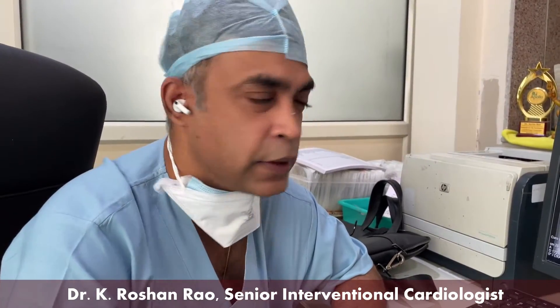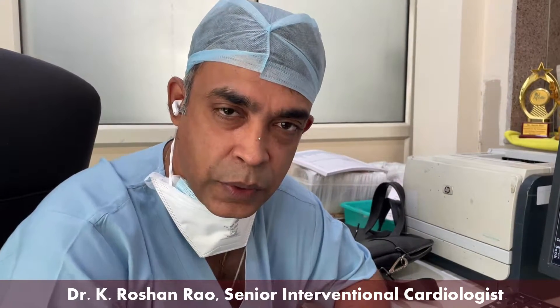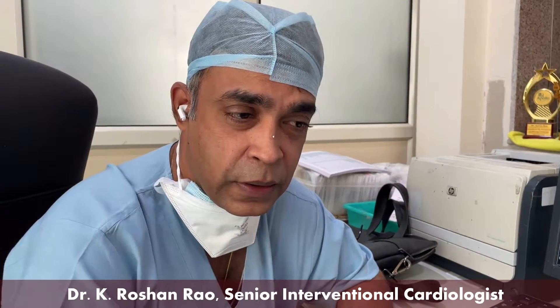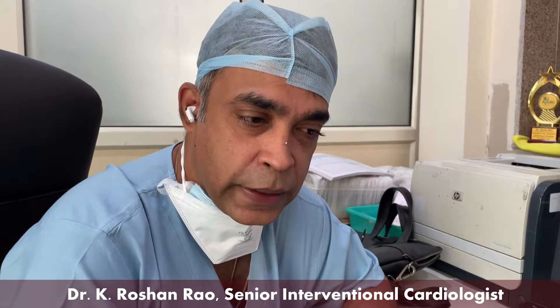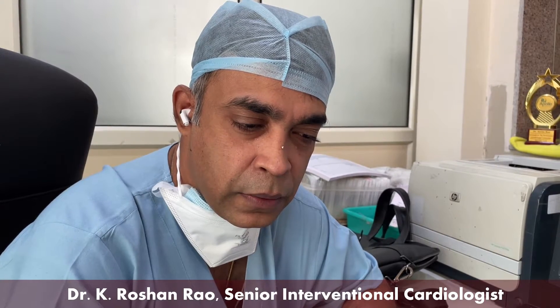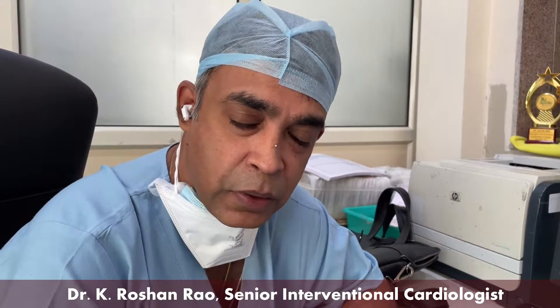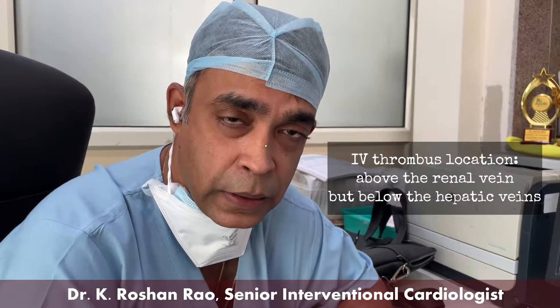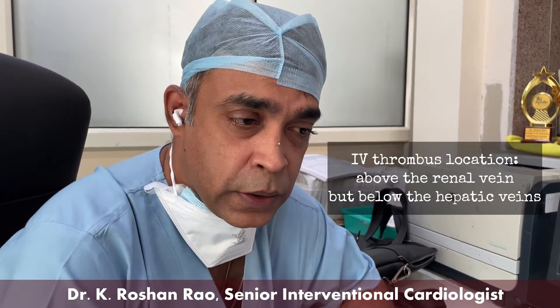This was a 35-year-old female who presented with severe bilateral swelling of short duration with pain. She was investigated outside and found to have an IVC thrombus which was 100% occluded above the renal vessels but below the hepatic veins.